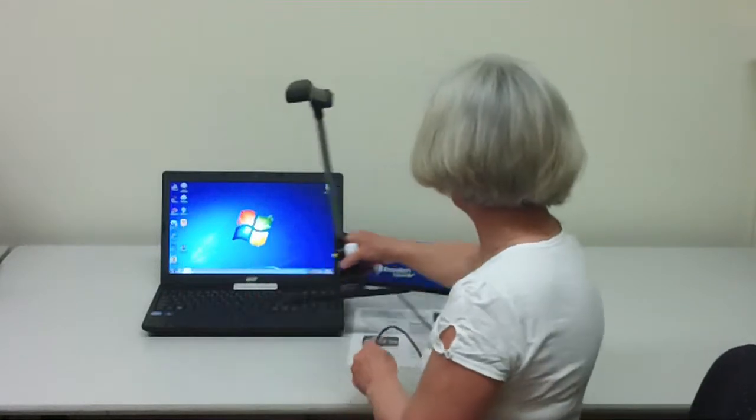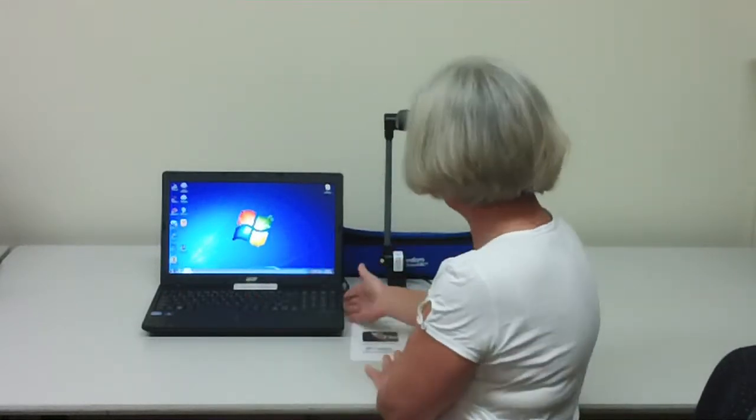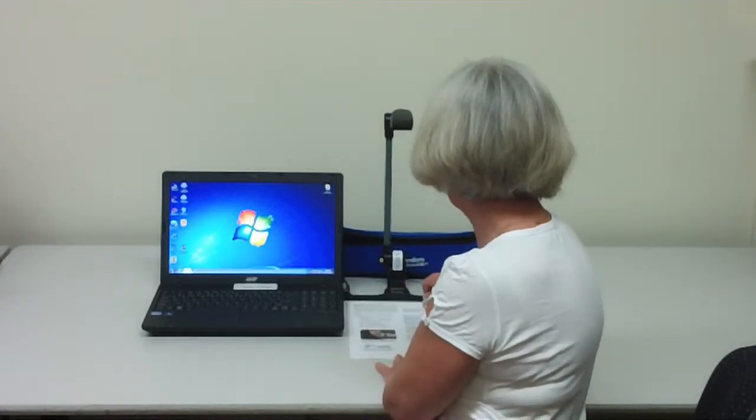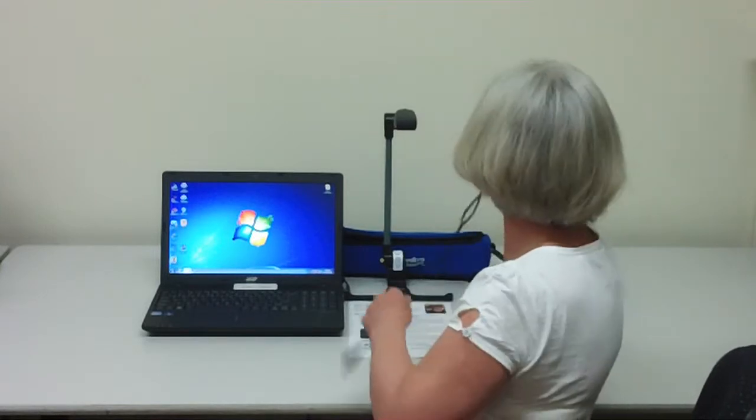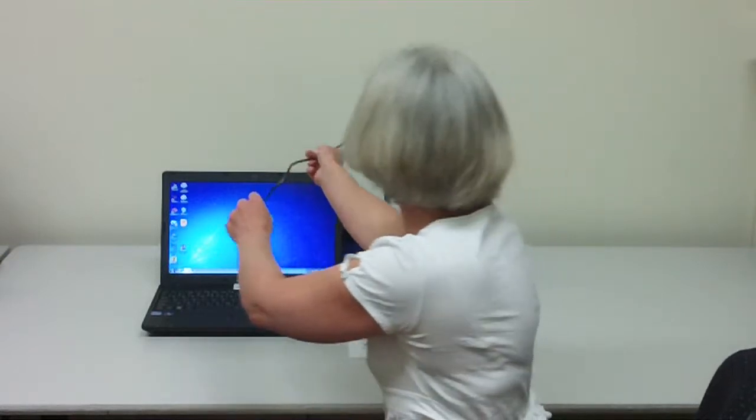Now let's organise it next to the computer so you've got a neat workspace and it's easy to work in this area. The paper guide is here next to the computer. I'll take the cable and plug in to the other side of the computer so it's not in the way of my scanning.